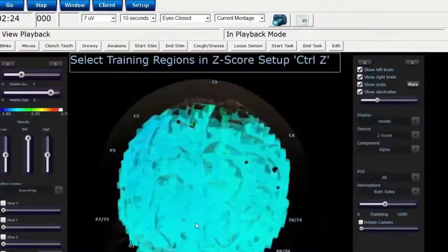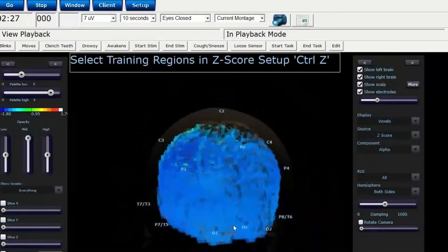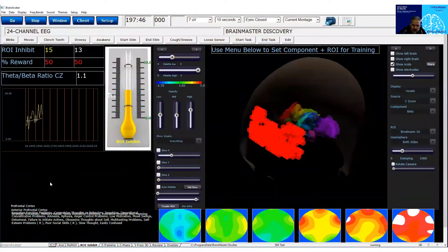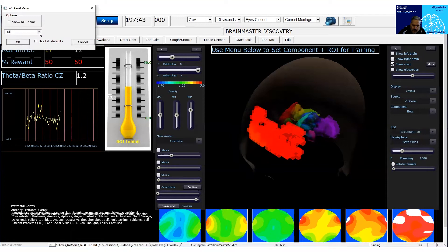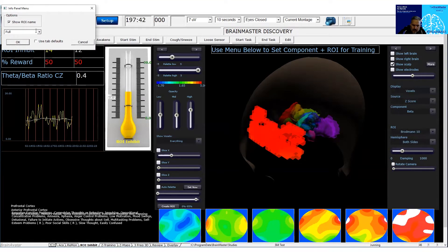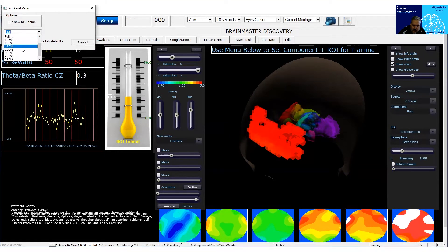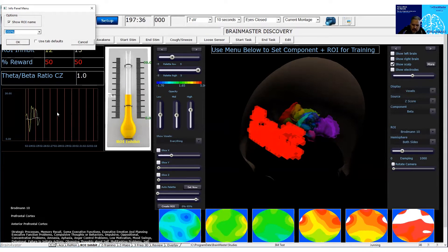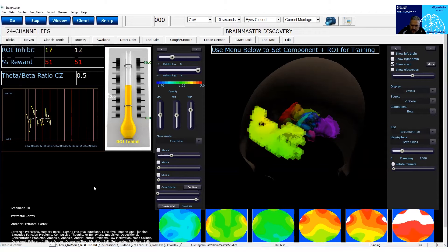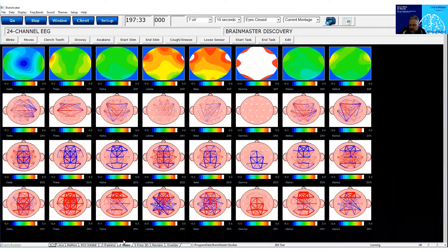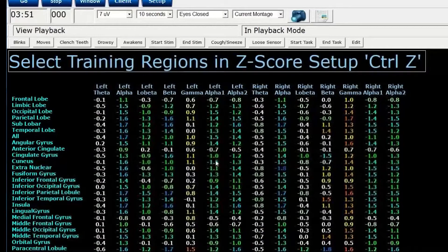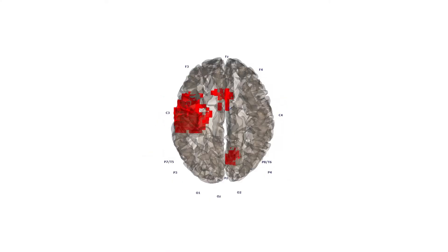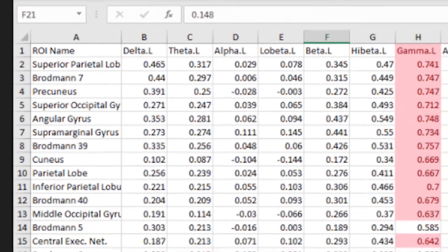Let's take a deep dive into the software itself. Brain Avatar's clinical EEG software delivers real-time live brain activity data for over 6,000 voxels with SLORETA, supporting multiple databases including both normative and clinical populations. With our newest 5.0 with eLoretta HD, over 12,000 voxels will include deep brain structures and connections. Our unique ZBuilder system provides the ability to construct individualized databases from any acquired EEG data.